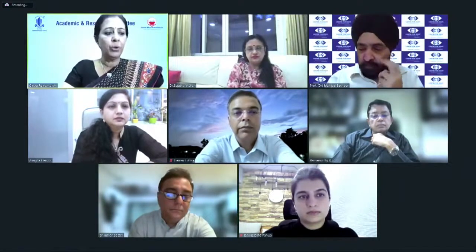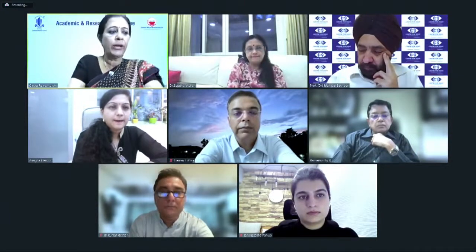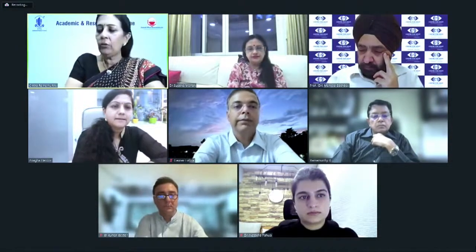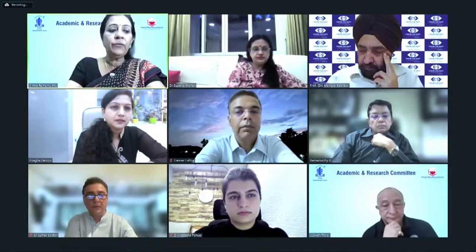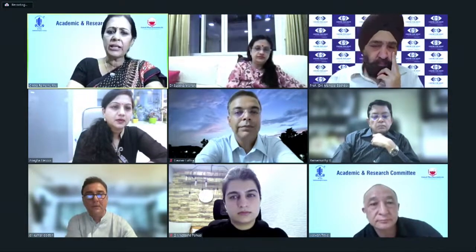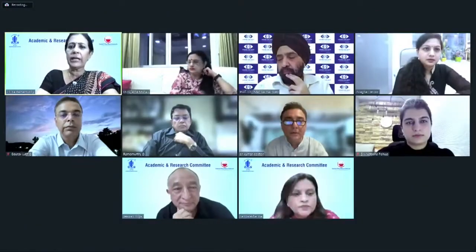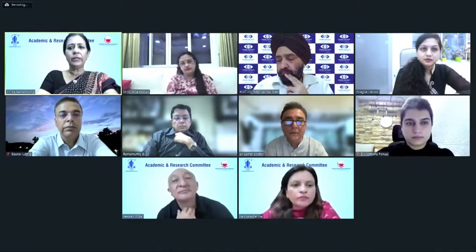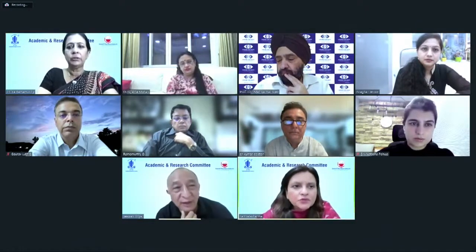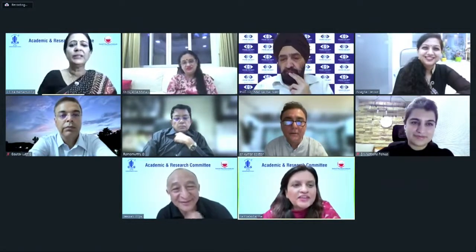Swelling of the flap also definitely adds to it and is an advantage. That is why they keep saying to hydrate the flap. But have any of you ever done something as drastic as considering sacrificing a flap if there's really recalcitrant striae and crumpled flap, like after some kind of a road traffic accident? Dr. Tityal or Dr. Namrata, have you ever felt that? No, I shall be covering that topic towards the end, Sir is going to show some of the very recalcitrant cases.